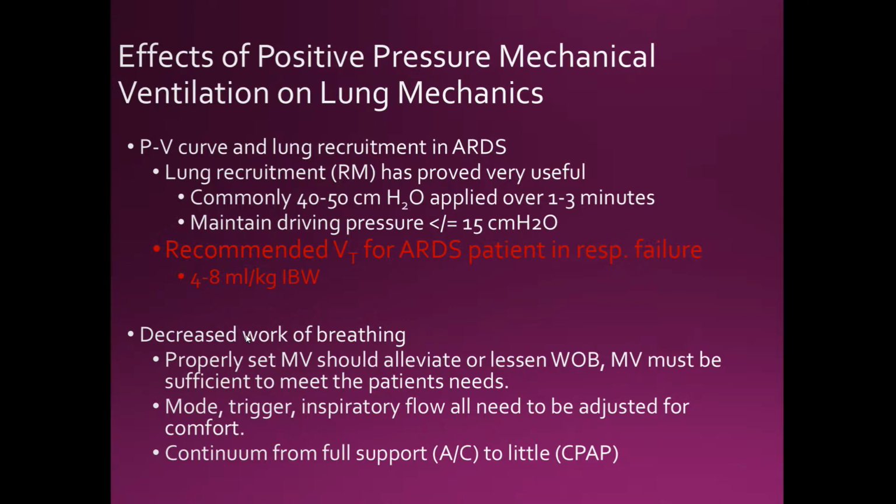If I have my sensitivity at -1 or -2, and they are auto-PEEPing at 8, they have to pull from plus 8 to 0, and then from 0 to negative 1. They have to increase that work of inspiration to trigger the ventilator. That is not comfortable, and that is going to increase the patient's work of breathing.